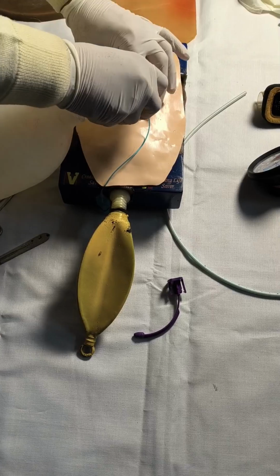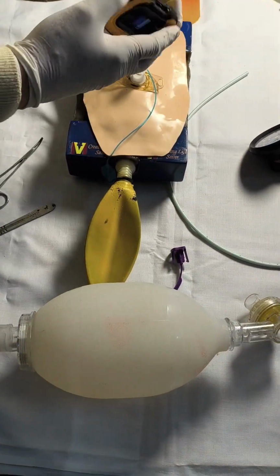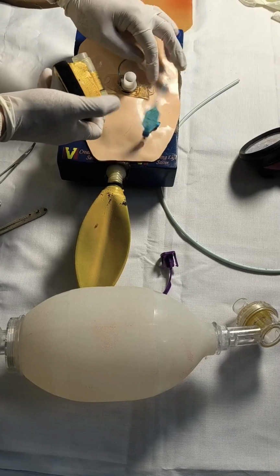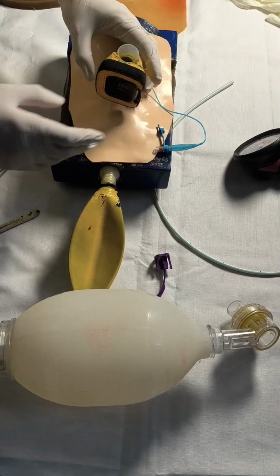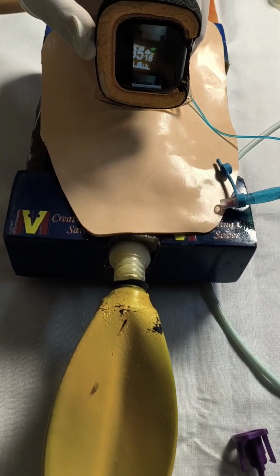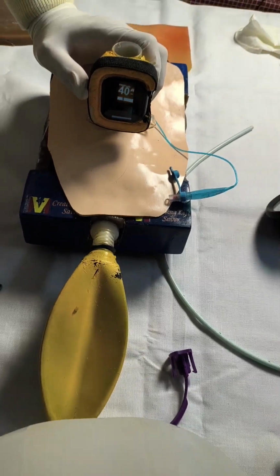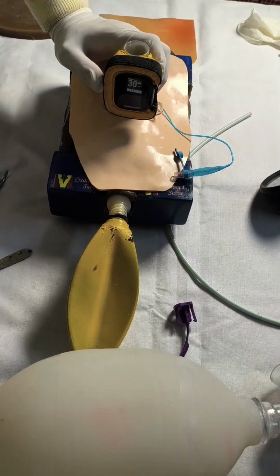And the second, of course, that should be the gold standard even in India, that we can attach the EtCO2 to a portable device. And now we have an EtCO2 number. How much? 40. So again, it is in the right place.